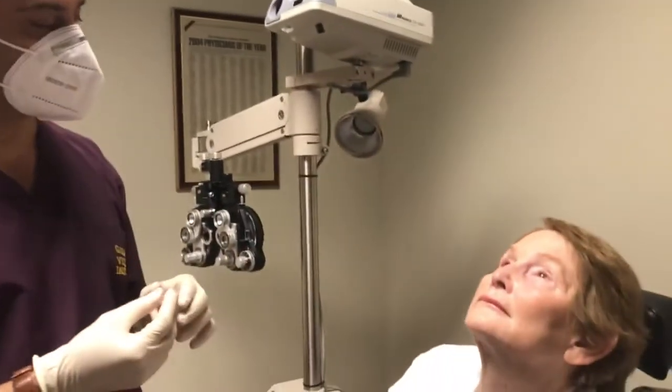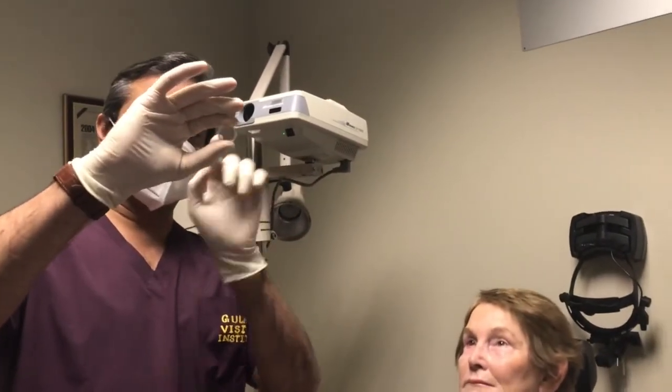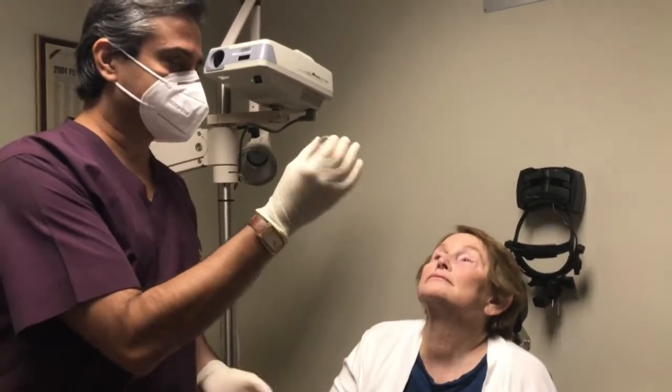And here she is. Linda, how do you feel? Fantastic. And if you see, she's used up her entire amniotic graft — there's nothing in this anymore. So it was a ring. Yes, it is big, but it sits on your lid there.